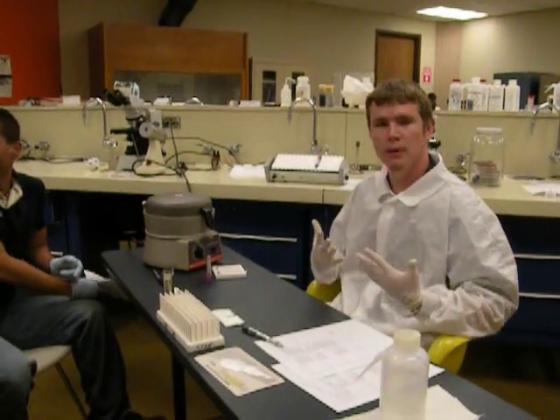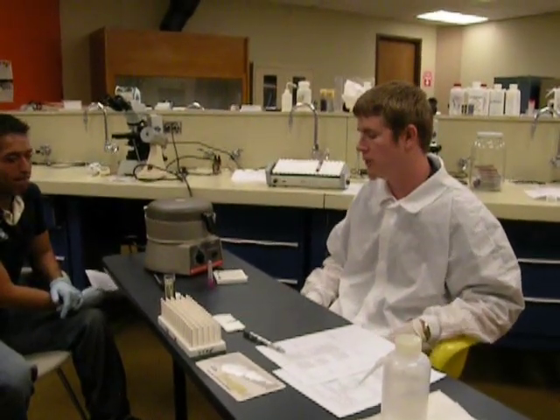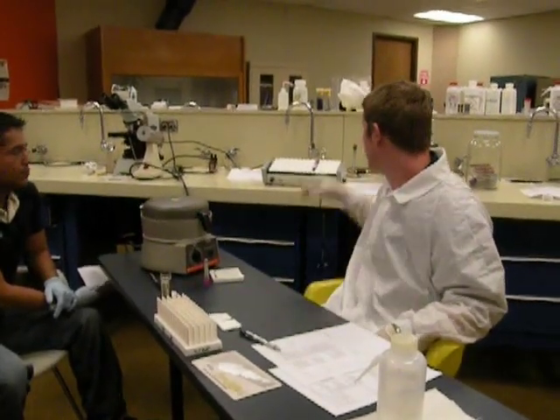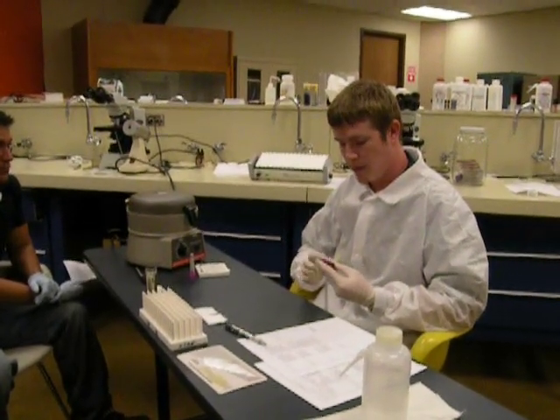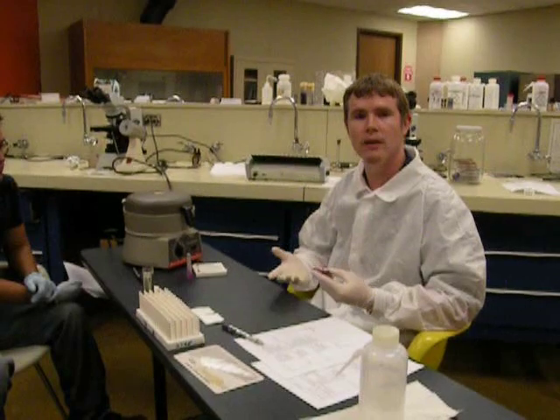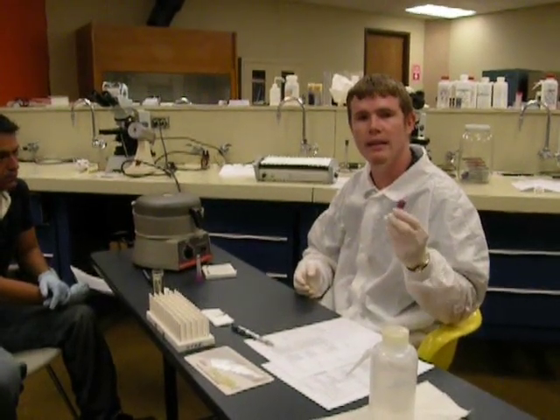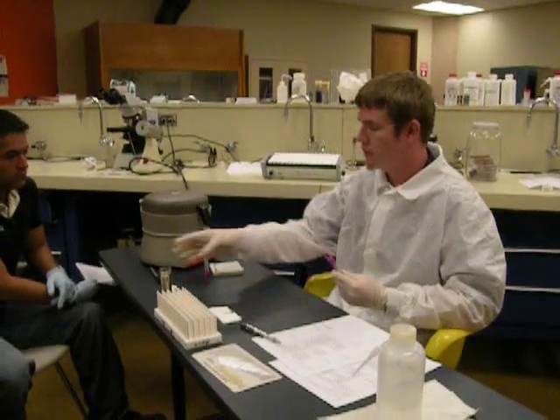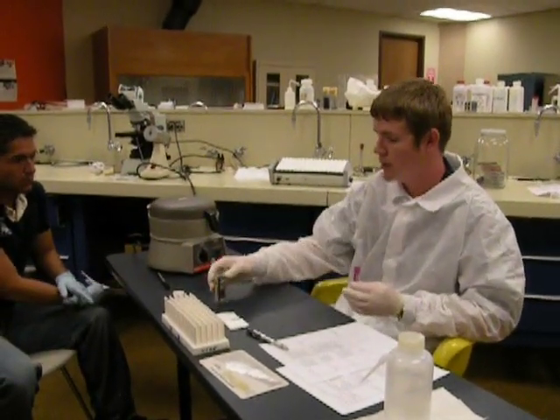First and foremost, you're going to need protective gloves and lab coats, so that you protect yourself from whatever the patient may or may not have. Next, you're going to need a blood specimen. If you're performing the specimen from a finger stick, you're going to need heparinized tubes, but today we're going to perform it from an EDTA tube — a purple top tube. The micro capillaries we're going to be using are just regular capillaries.